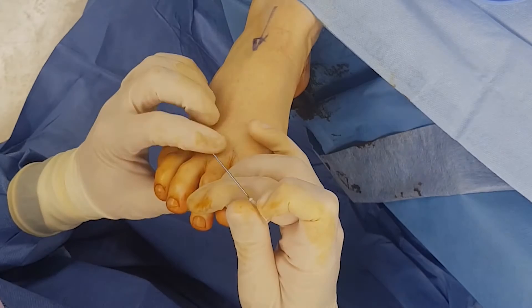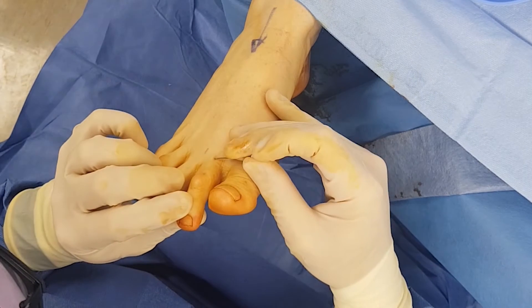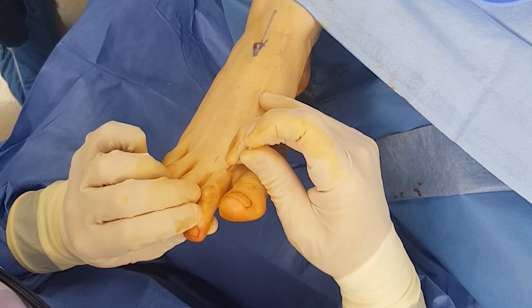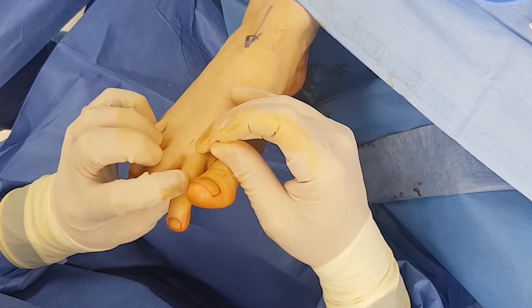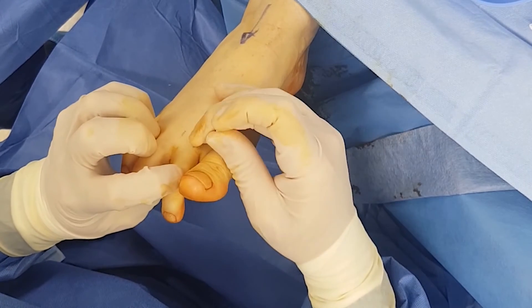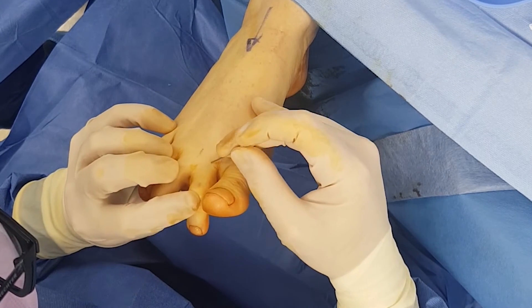So let's get started on the procedure itself. Because at the MTPJ level the deformity is flexible, a soft tissue release is plenty to get that into a rectus position. So with the 19 gauge needle, I've made a small incision, and I am now cutting the extensor digitorum longus tendon. With this percutaneous tenotomy, it is quite minimally invasive, and it was quite easy to get the MTPJ to a rectus position.